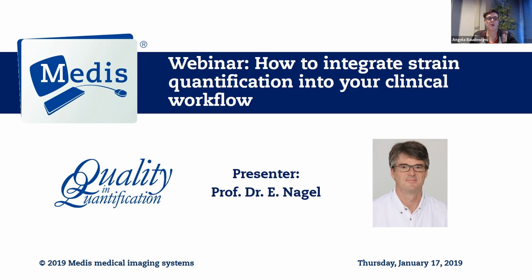For today's webinar, we are pleased to have Professor Nagel from University Clinic Frankfurt, Main in Germany, who will give a presentation, also a live demonstration. Professor Nagel will share his view on the role of strain for clinical routine measurements, and also he will provide a demonstration of a simple and quick workflow to measure strain. So we would like very much to look forward to his presentation.